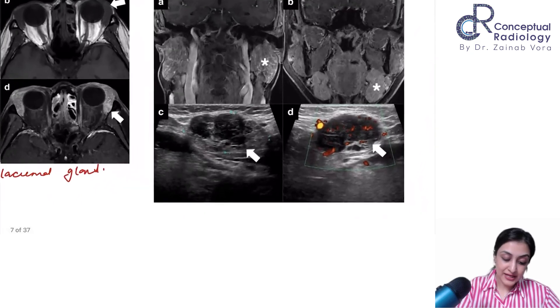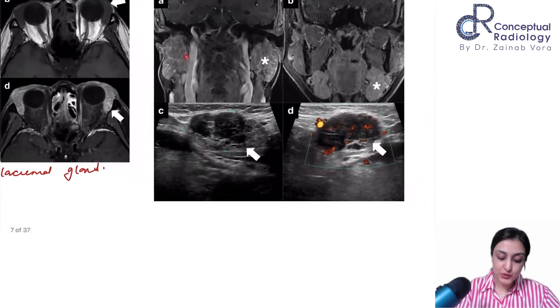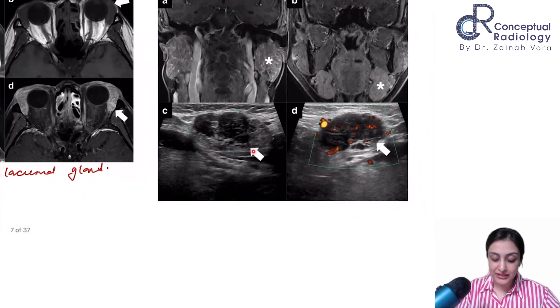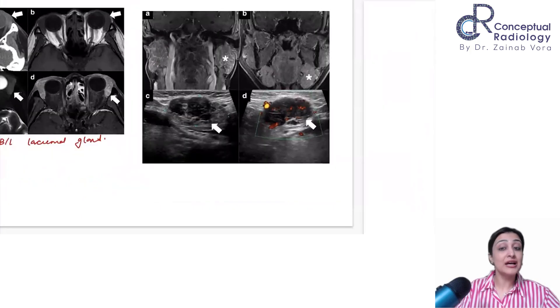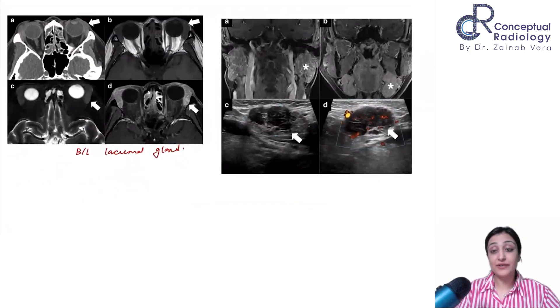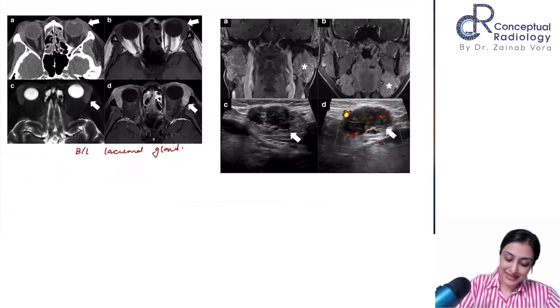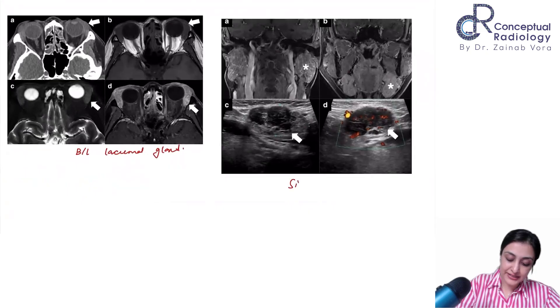Next case: salivary gland involvement. You can see bilateral parotid enlargement and bilateral submandibular enlargement. Ultrasound shows hypoechoic enlargement with Doppler uptake. This is bilateral sialadenitis.